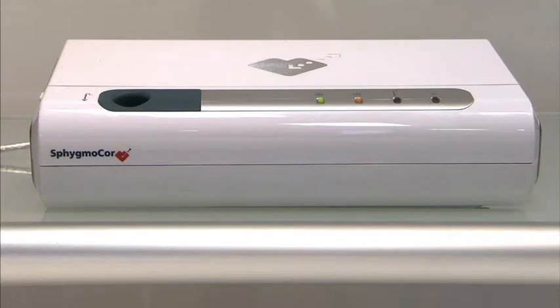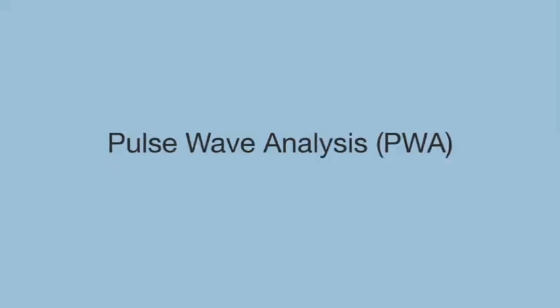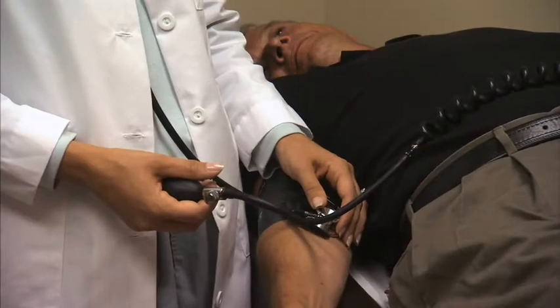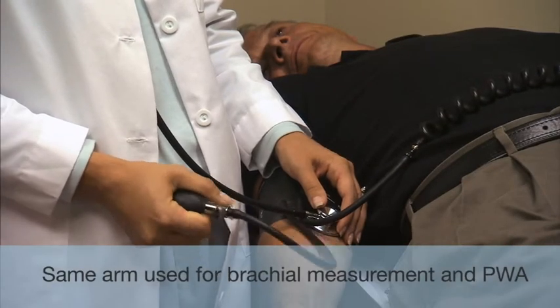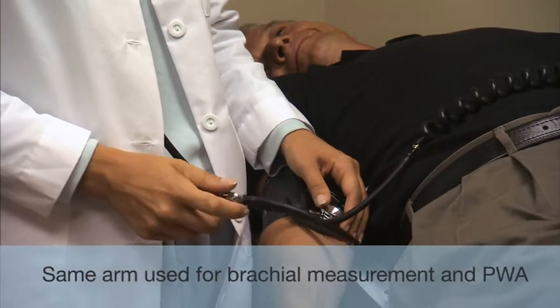SphygmoCor pulse wave analysis is performed to measure central blood pressure, the pressure at the ascending aorta, and assess arterial stiffness. Take the subject's brachial blood pressure. As always, strict compliance with procedure is vital in assuring accurate brachial blood pressure measurement.